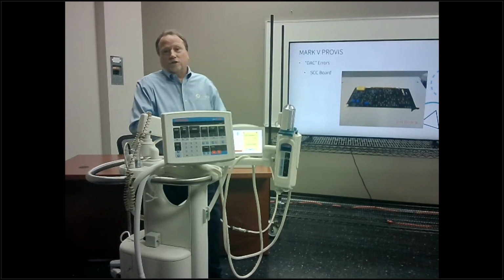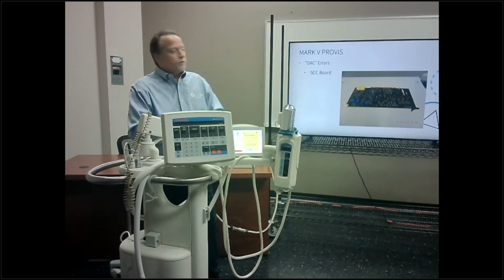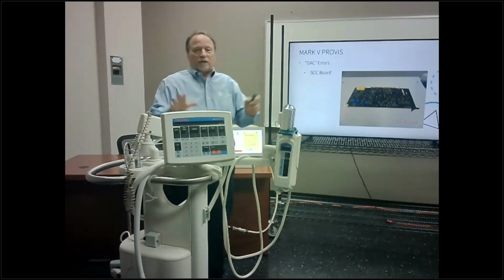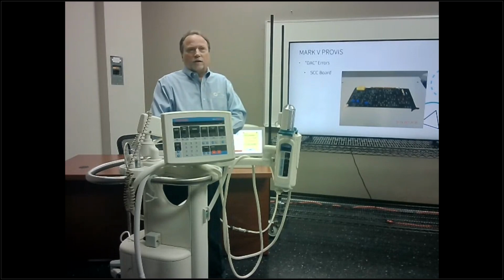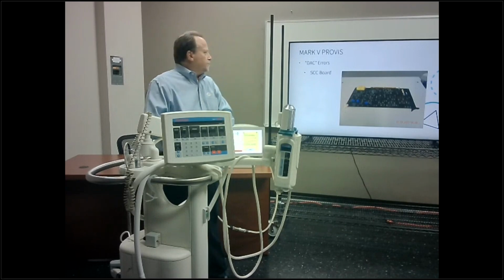DAC errors, digital analog digital converter, SCC card. If you get DAC errors, it's the SCC card. Servo control card. That's what controls all that information. Okay. And if you get those errors, I think that it's DAC overload or DAC overvalue, then it's your SCC card.